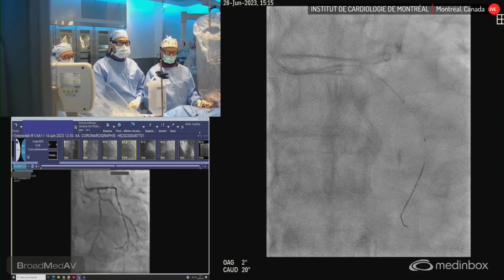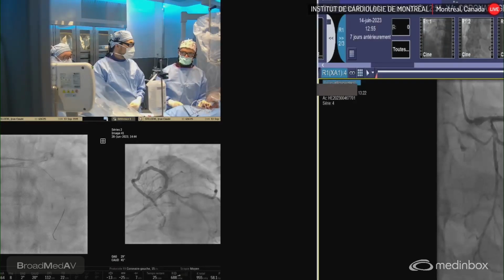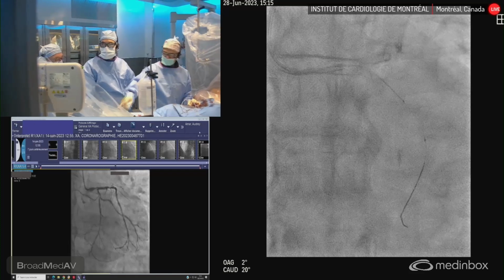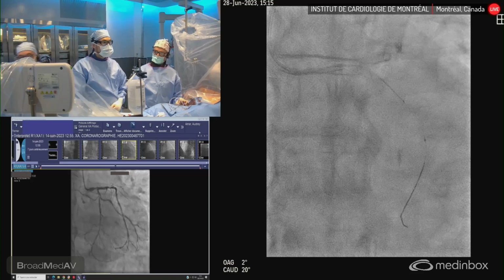The patient is now quite stable and not in pain. Keep in mind, last week the patient was not able to tolerate more than 5 minutes of the angioplasty. He had severe back pain, which basically pushed the procedure to today, but probably his hematoma has improved a lot. We considered anesthesia here, but we're doing mild sedation. I think now he's stable. Very stable. Very few times a year we have to consider sedation.